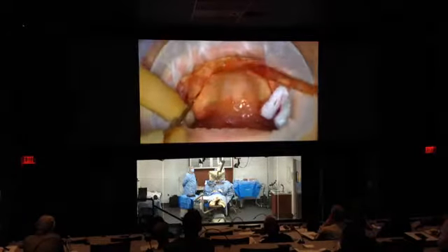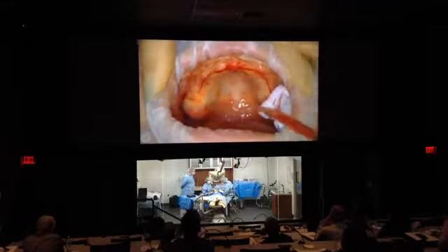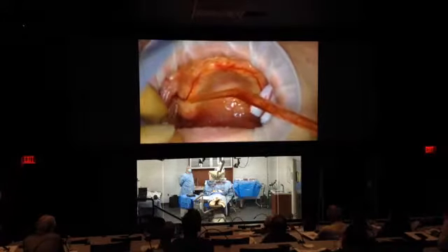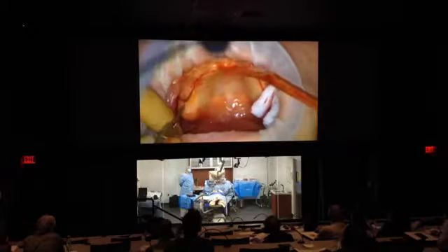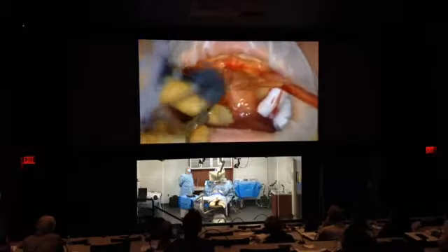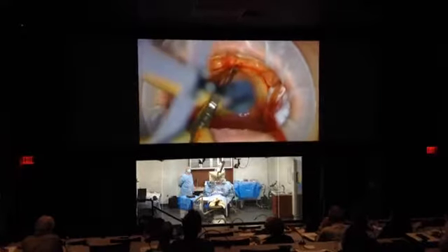Okay. And if you notice, I have this lip retractor here, which I love to use. Anytime I'm doing full arch cases, whether it's restorative or surgical, I like to have this on. It's a great lip retractor, one less thing to worry about. I'm going to go back through my incision here. I want to make sure I'm all the way to the bone. Very, very important before I even start reflecting here.